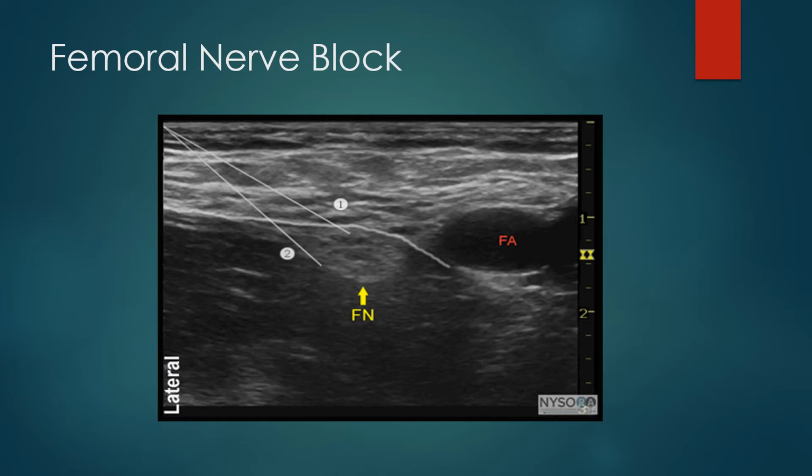One can also simply put the needle down through the fascia iliacus and put local anesthetic on top of the muscle between it and the fascia, and it will spread here both medially and probably laterally to capture the lateral femoral cutaneous nerve.